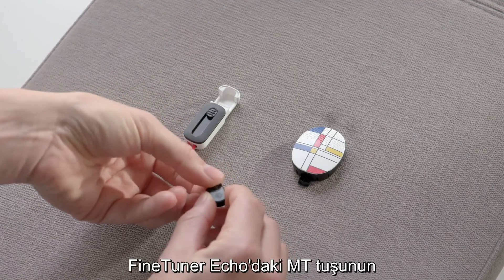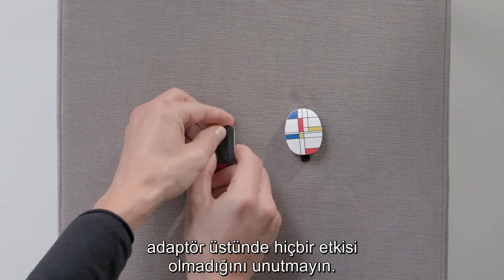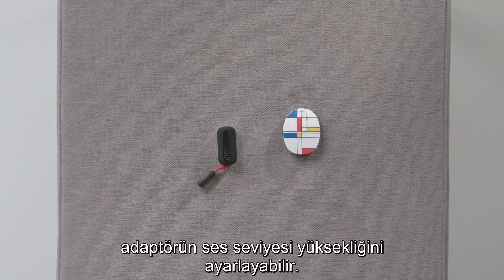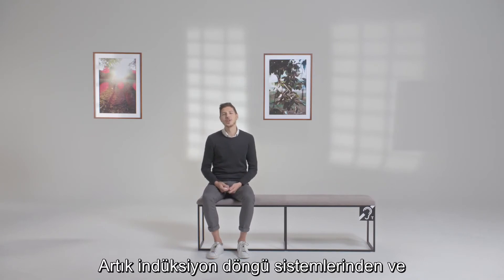Please note that the input selection key of the fine-tuner echo has no effect on the telecoil adapter. Your healthcare provider can adjust the loudness of the adapter for each audio processor program. Now you can enjoy using hearing loops and telecoil-enabled phones.